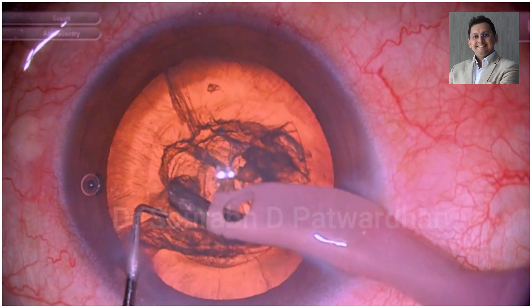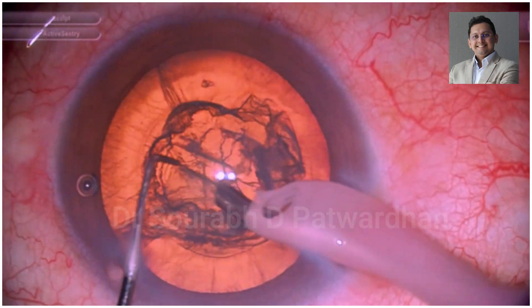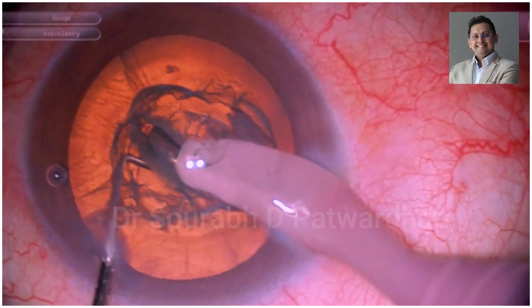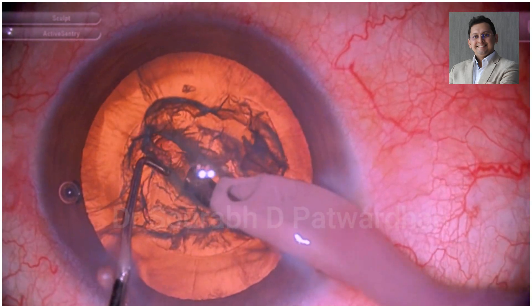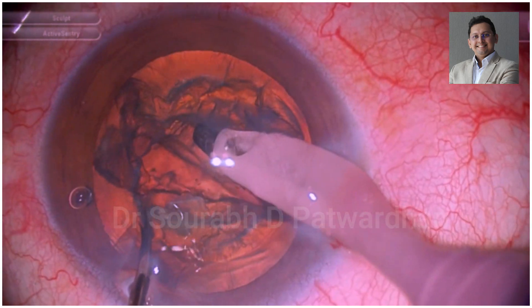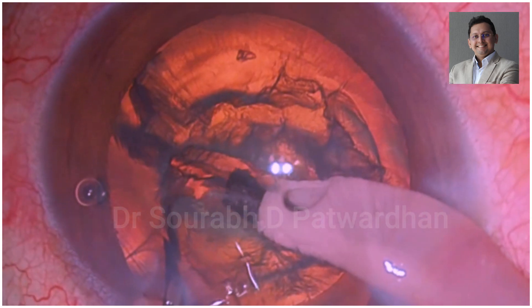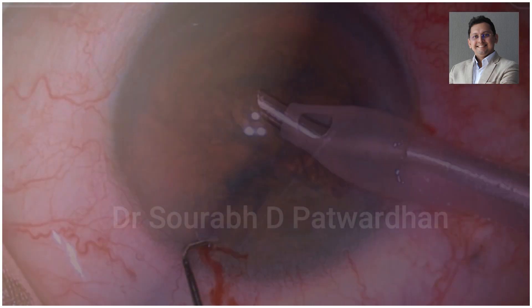Here I will show you in a couple of cases. This is a soft cataract. First, a deep trench is done in the central part of the nucleus. We have to reach almost 80-90% of the depth in order to achieve good division. Now just watch the position of the tip of the chopper. I am using a 1.5 mm long blunt tip, which is a modified Sinski — I call it Patvardhan's modified Sinski — where the tip is 1.5 mm.